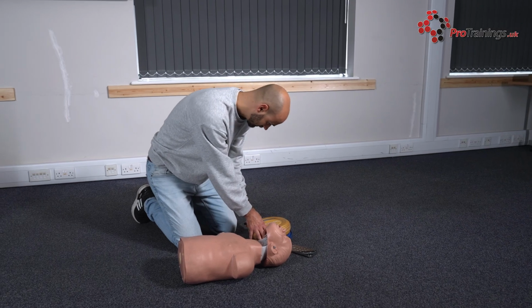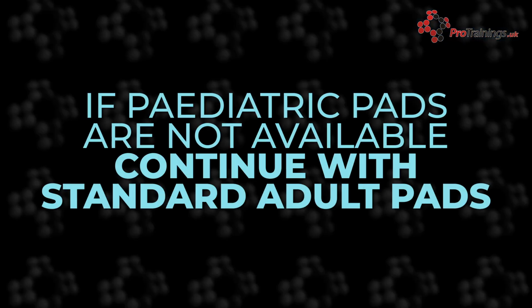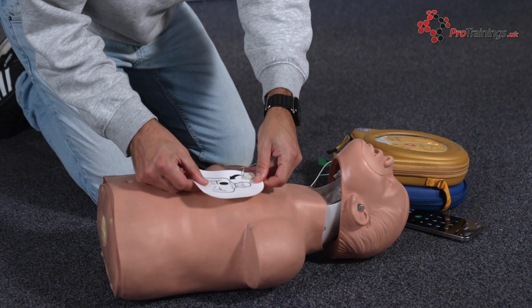If the AED has a paediatric mode or paediatric pads, use them. They reduce the shock energy to a level suitable for smaller bodies. If paediatric pads or modes are not available, use the adult settings. Never delay defibrillation. Apply the pads correctly.